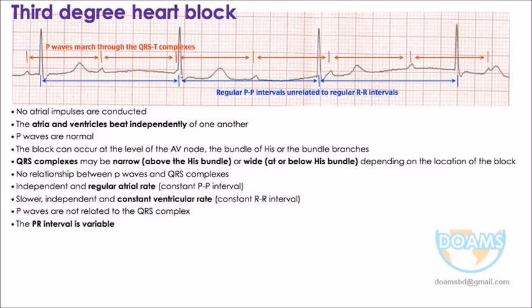The blue color is the QRS, the gap, the RR duration. The red one, you see the P. P and QRS. Another P is here, another P is there, another P is here. But if you make a relationship of P to the QRS, it is not a fixed relationship. It is random.